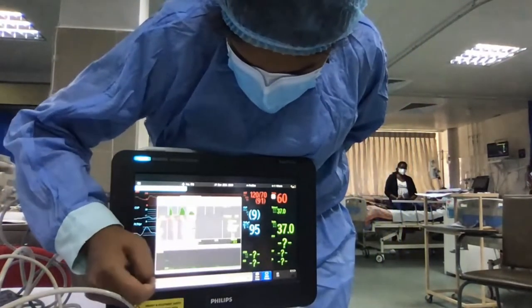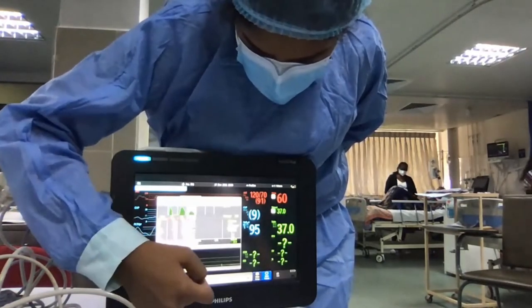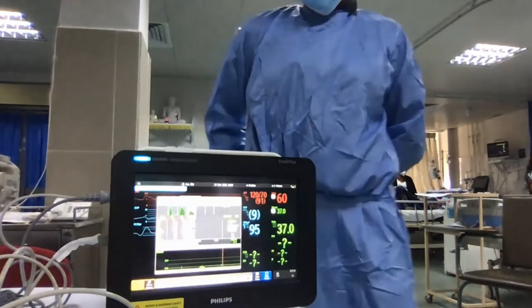Of course, the monitor will say whether it is effective or not. Stable baseline, inject now. So we'll see how you get an overall number. How do you get the cardiac index?